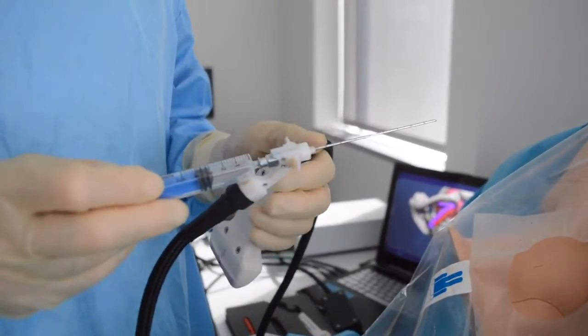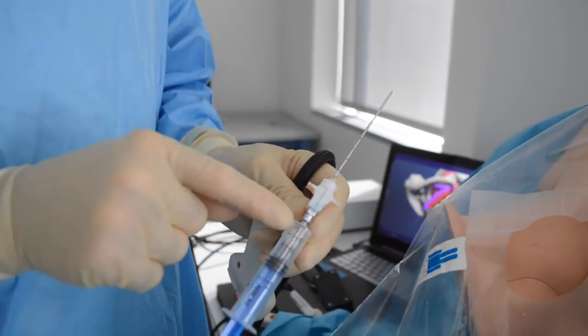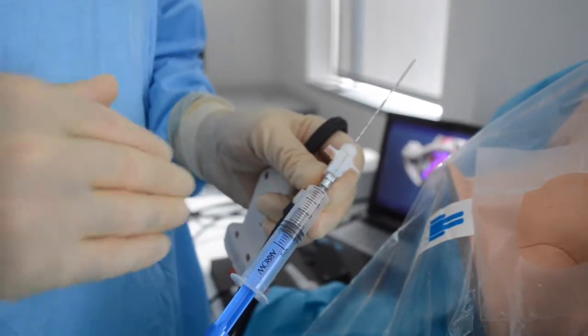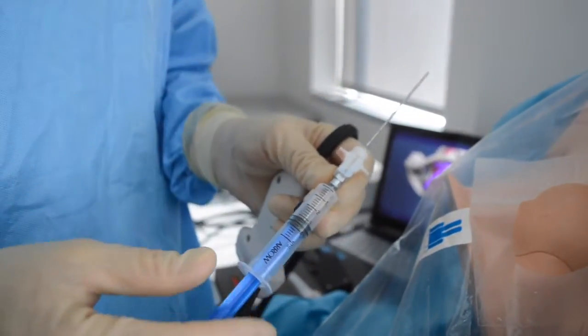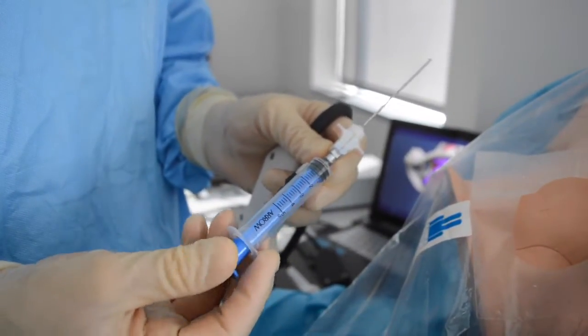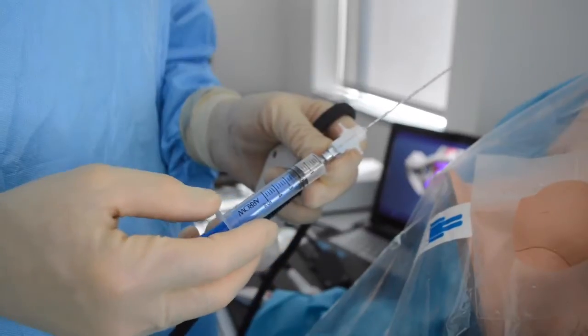When you do central vascular access, it is convenient to line up the numbers on the syringe with the bevel so you always know which way the bevel is open. You also want to crack the syringe before you use it so it doesn't have that stickiness that happens.